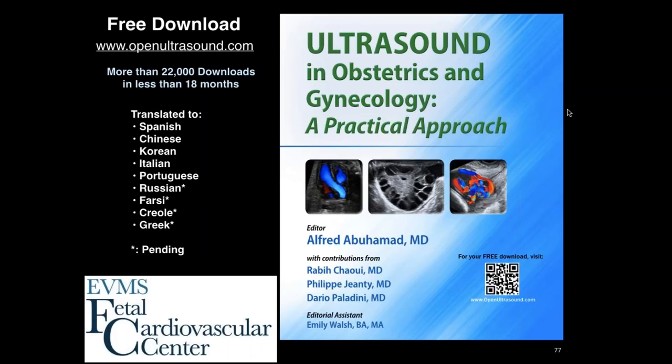Do you recommend screening of the fetal heart of the obese gravida? Well, good question. There is increased risk of congenital heart disease. It is not part of the national criteria for fetal echo. Certainly for fetal screening, I would say certainly for a detailed ultrasound exam, 76811, there's a window between 12 and 15 weeks where you can get a lot of information from those patients, either transabdominally or actually transvaginally, to get the anatomy.